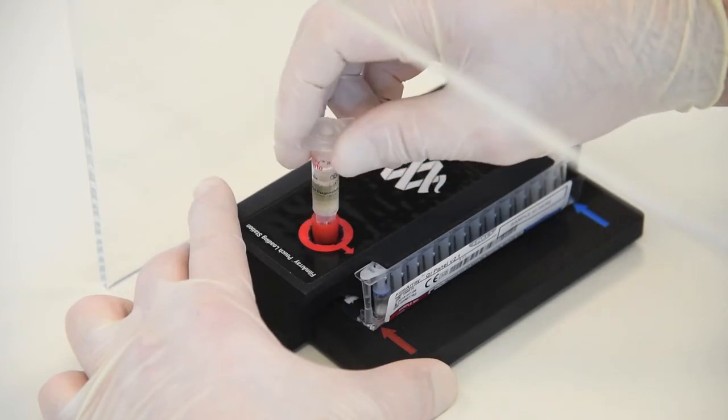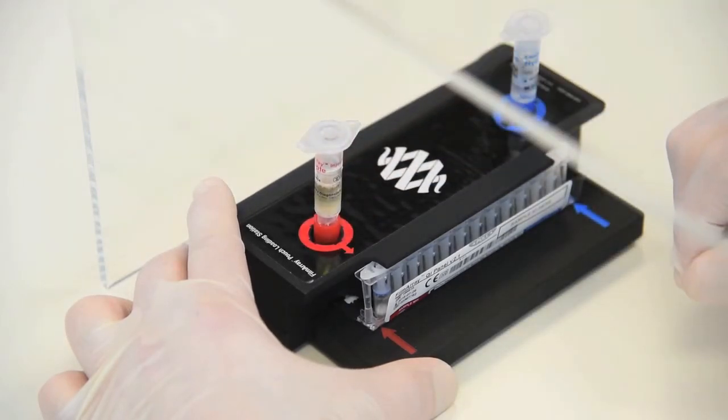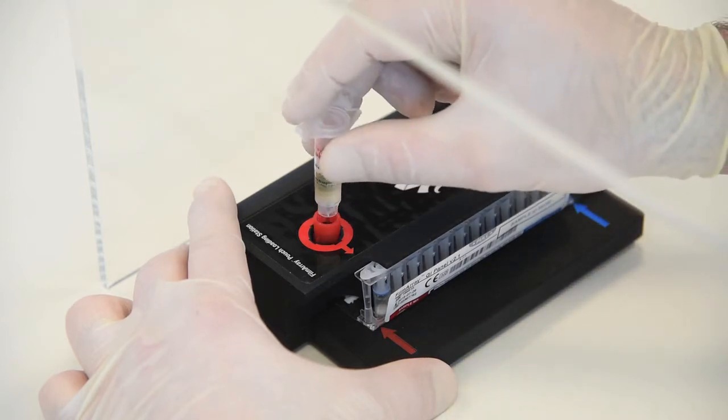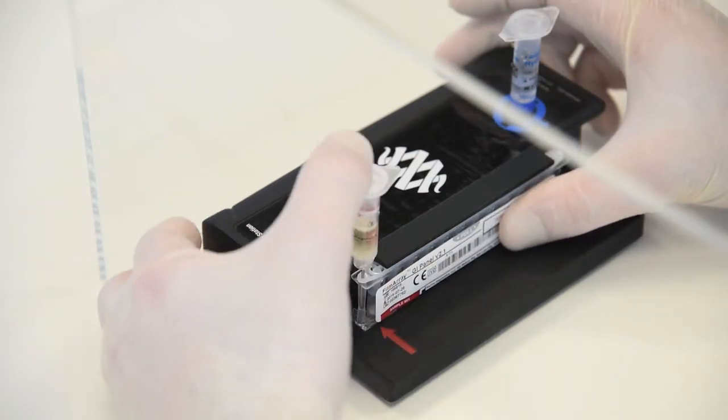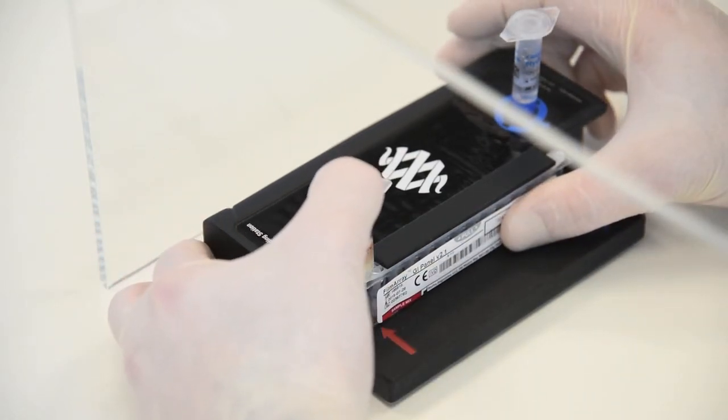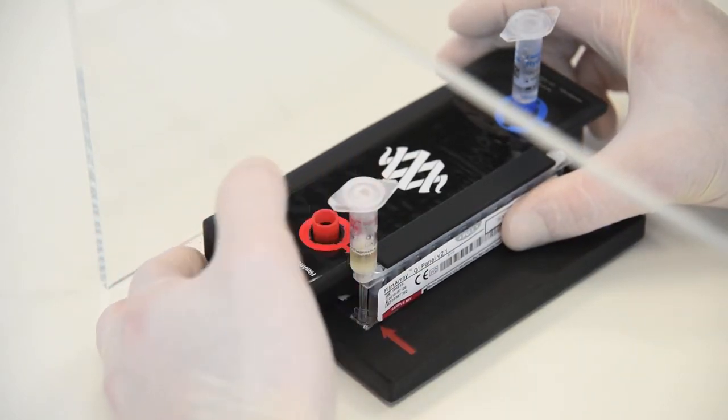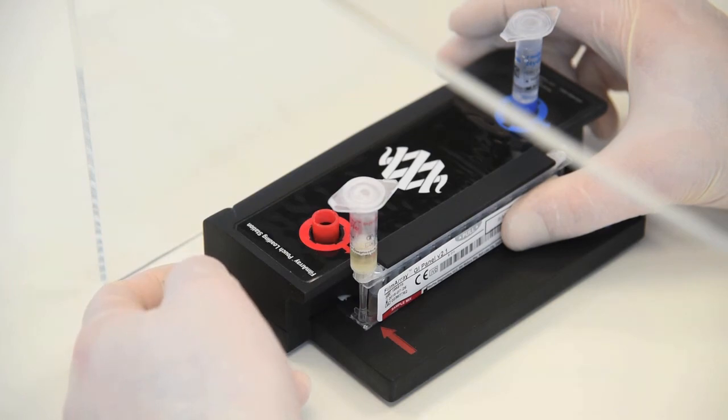Step 4, Load sample mix. Unscrew sample injection vial from cap. Pause for 3 to 5 seconds. Then remove sample injection vial, leaving cap in pouch loading station. Insert sample injection vial into pouch sample port. Forcefully push down to puncture seal. Wait as sample mix is drawn into pouch.